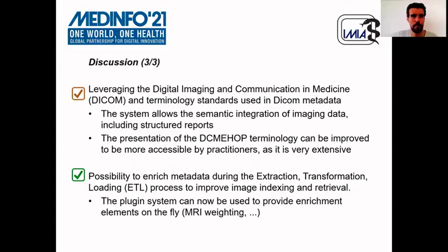And finally, the plugin system can now be used to enrich the imaging data and compute features on the fly. For example, the sequence used during MRI acquisition is not specified in DICOM attributes, and it could be a good use case to compute this information from the input DICOM files.